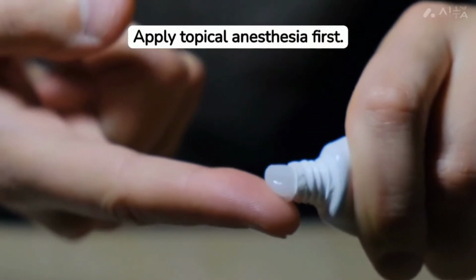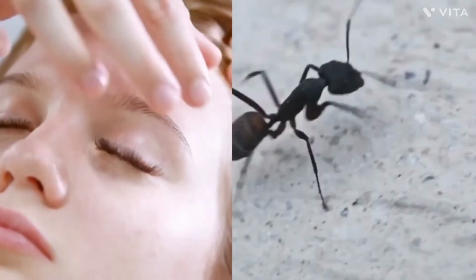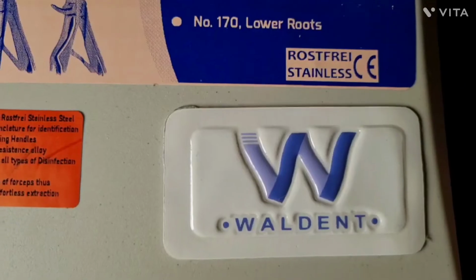Before giving local anesthetic, apply a topical anesthesia first. And before you start the procedure, explain the sensation of pinching or ant biting to the child so that the child is not scared of the injection.